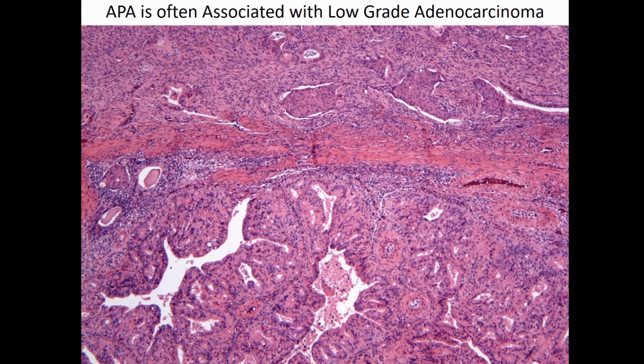One important thing to remember here is that we all see way more atypical polypoid adenomyomas than we know, but we usually just see them as endometrial cancers. So next time you're looking at a hysterectomy with an endometrioid adenocarcinoma and it's got a lot of squamous morules in it, look around and see if you can find the precursor APA that it came from. It's a great way to see these in their normal histology.